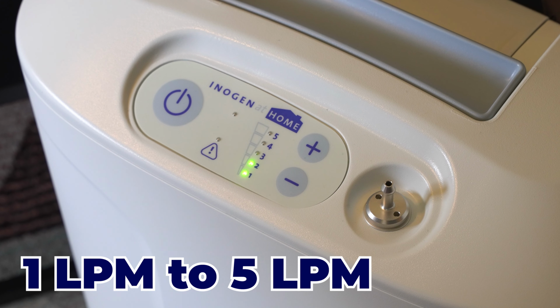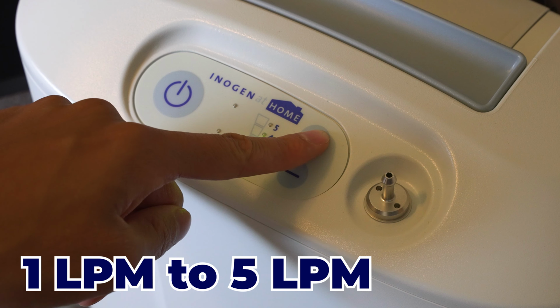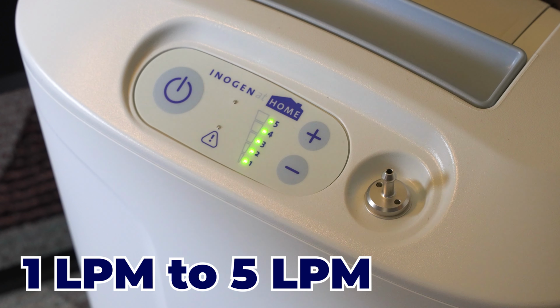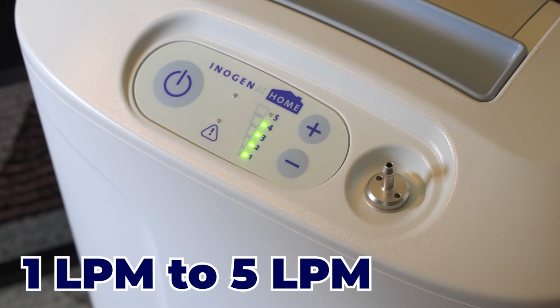So the next thing I want to talk about is just the flow rates. Super easy, you just plug it in, press the power button, and then you can cycle between 1 and 5. Each number refers to the liters per minute. So a number 1 is going to be 1 liter per minute, 5 is going to be 5 liters per minute. And like I said before, that's going to be continuous flow.